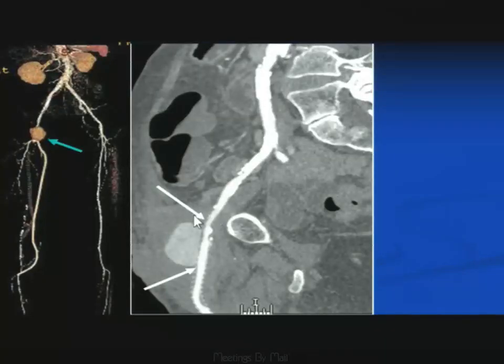So here's another example of a patient who's got an aneurysm. I think this patient's aneurysm formed at the upper aspect of a femoropopliteal above-knee graft. And again, here we're seeing the aneurysm itself. Here's the more proximal popliteal artery. This is a curved plane reformation that's following the aortoiliac system down to the level of the femoral.